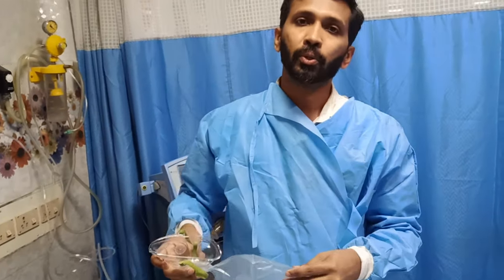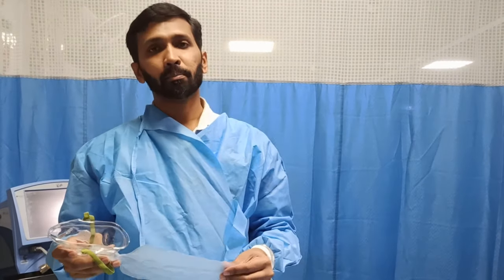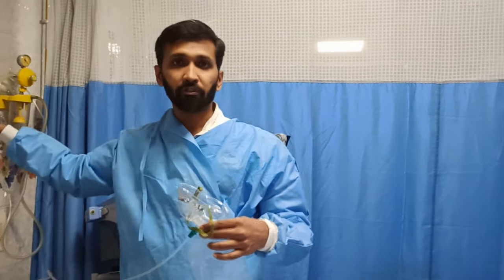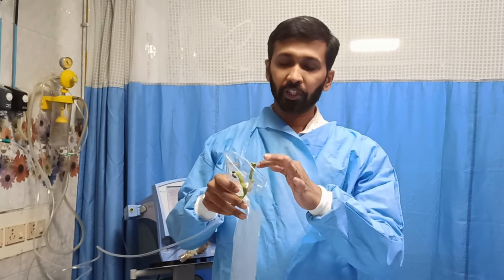And the most important thing, as I already told, is that the patient takes oxygen from this mask. Normally a patient takes a tidal volume of around 500 and has a breath rate of 28 to 30 per minute, so definitely he may need 15 liters per minute of oxygen. Depending upon that, we should give the oxygen here, because whatever oxygen you are giving from the flow meter is all the patient is getting. Otherwise, the patient will start to breathe his own expiratory air.